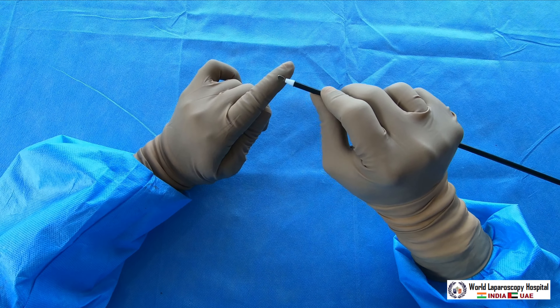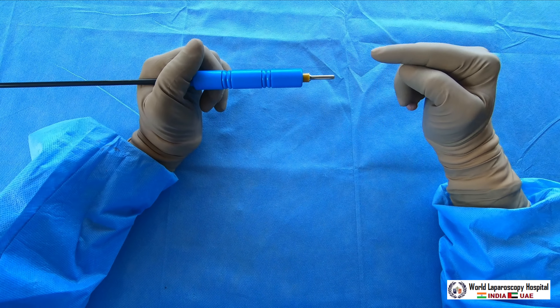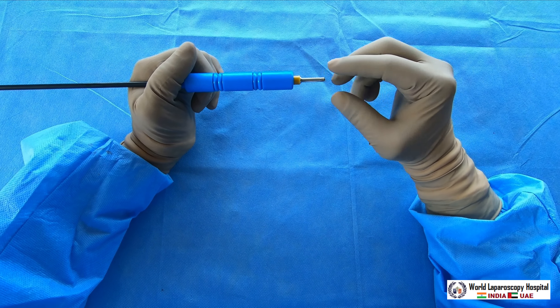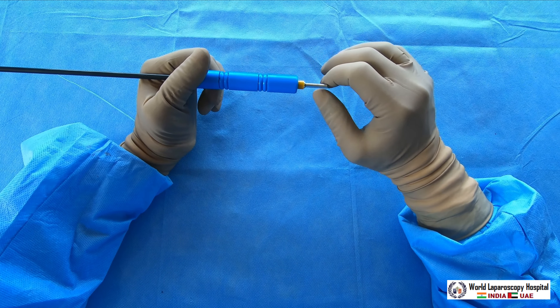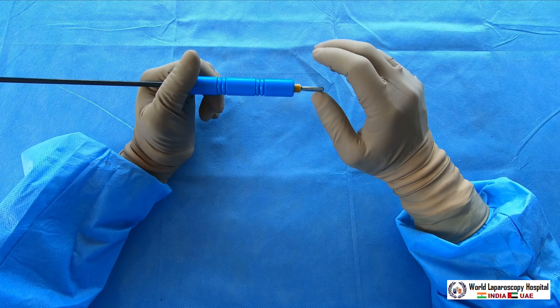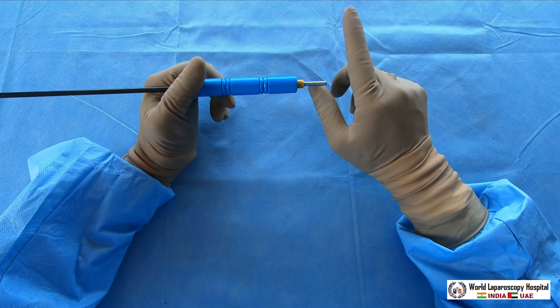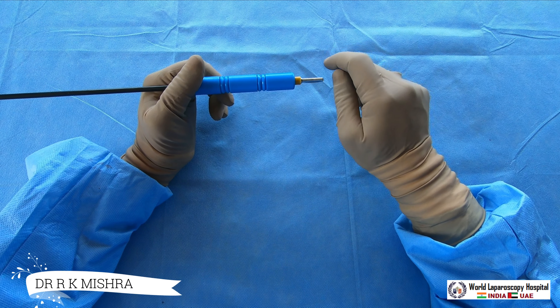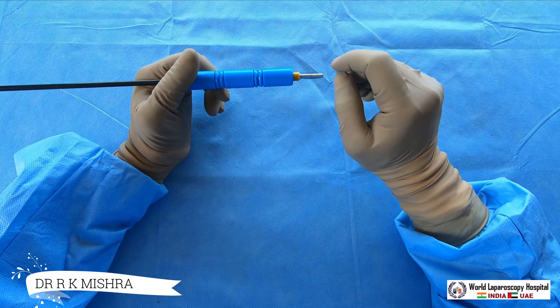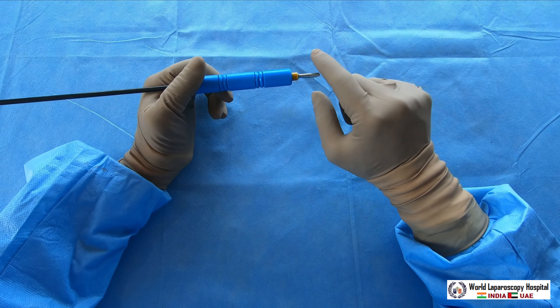This is a very good instrument used in laparoscopic surgery. It is essentially a monopolar instrument. Spatulas are mostly monopolar, and if bipolar, it will only do desiccation. Bipolar cannot do spray mode and cannot do fulguration — for fulguration, monopolar is essential.